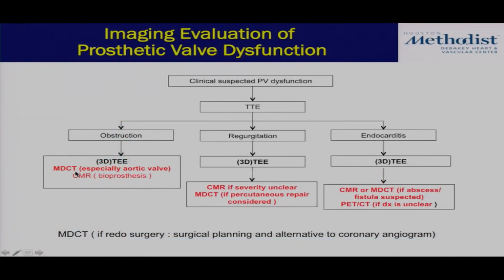There may be a role for CT in some cases, especially if it's for the aortic valve. And then CMR could be helpful in bioprosthetic valves, but in mechanical valves, I don't think there's really a role for CMR if you're looking for obstruction.